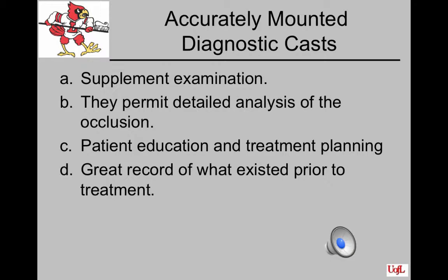Just think about it. If we could remove the lips, the cheeks, and look at the patient's teeth from the tongue side, how much more helpful that is than just being able to look into the oral cavity as we have to do with all of those things present.